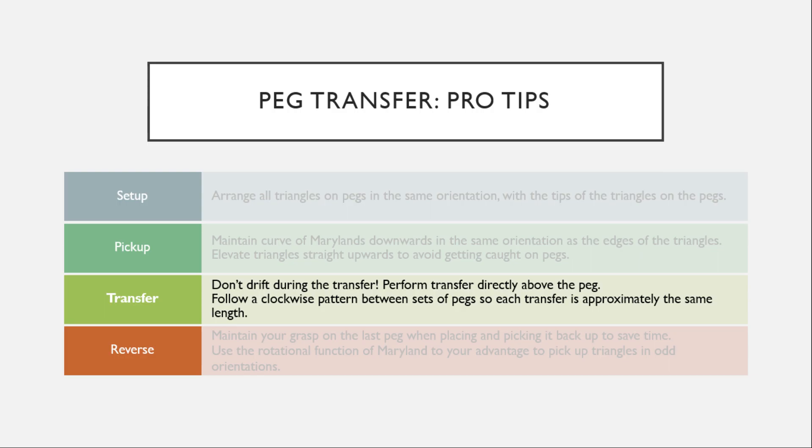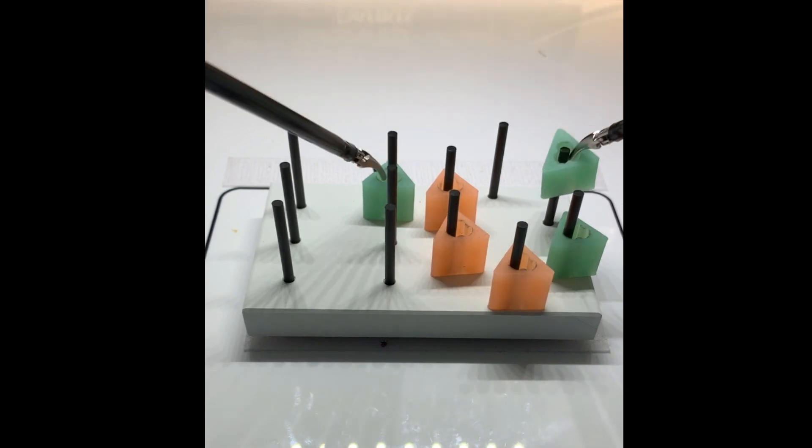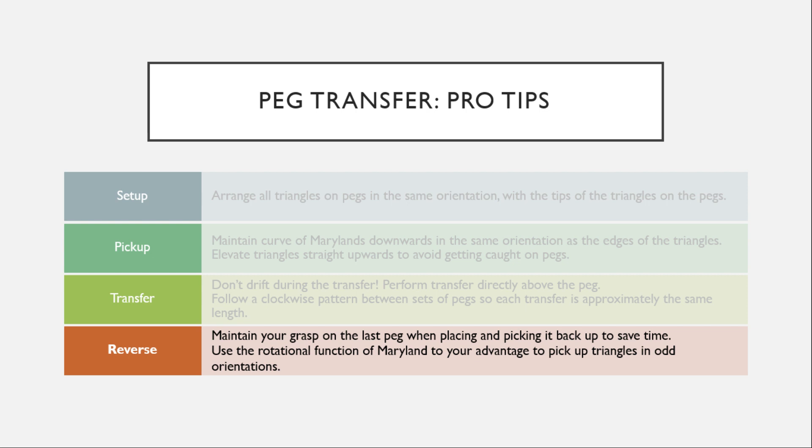The next tip is to be sure that you don't drift during the transfer. Perform the transfer directly above the PEG. You should also follow a clockwise pattern between sets of PEGs so each transfer is the same distance. In order to save time, maintain your grasp on the last PEG when placing and picking it back up.